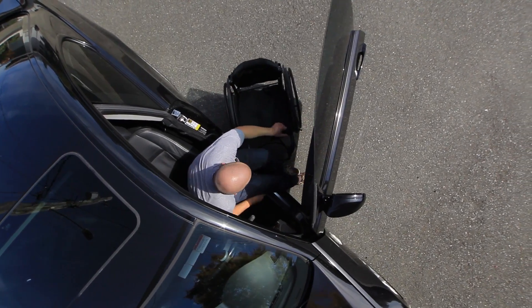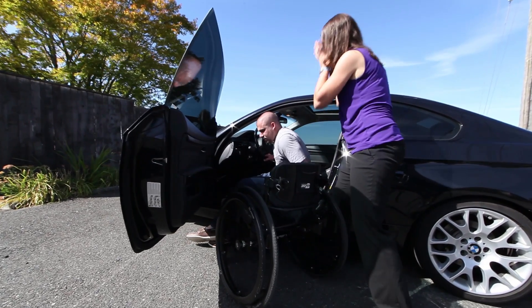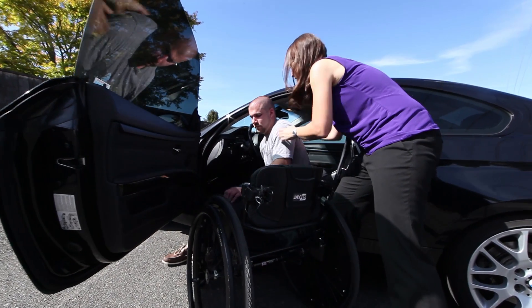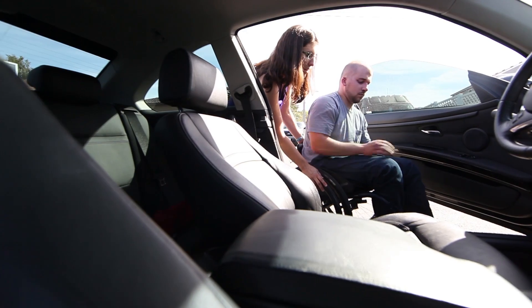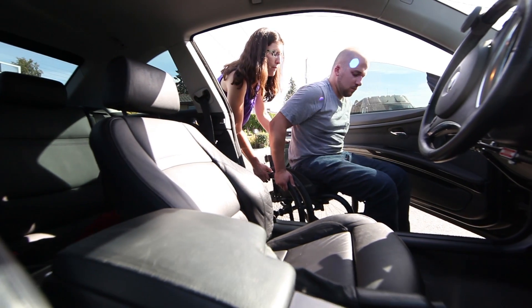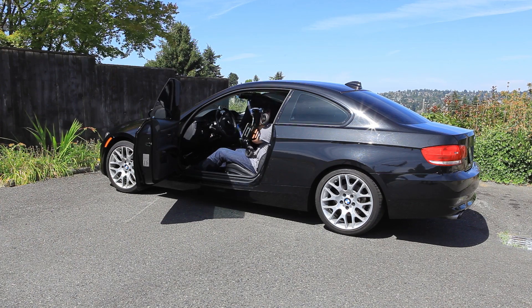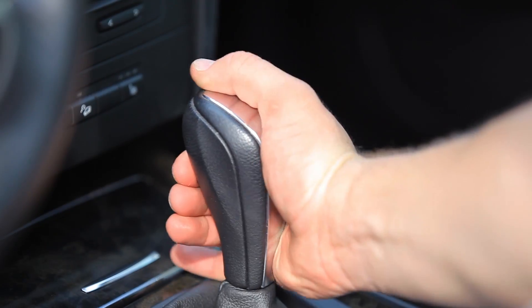Many wheelchair users are able to transfer into standard vehicles. If you continue to struggle with this transfer, talk to a therapist who is also a driving specialist. These therapists can explore modified vehicle options involving ramps or lifts. They can also help you determine whether you can load your wheelchair on your own or get back to driving.